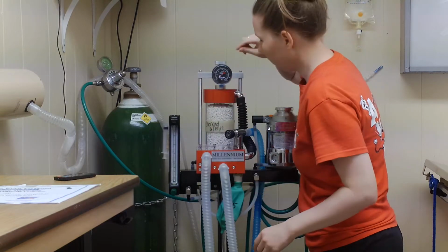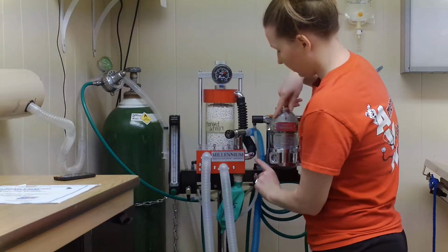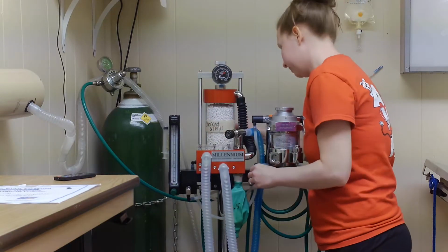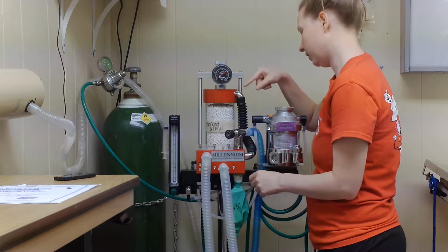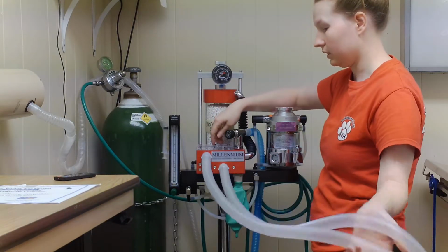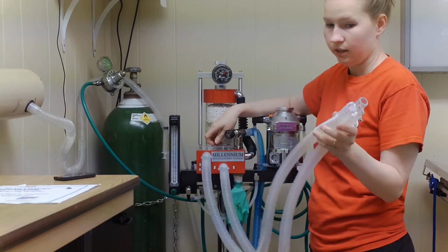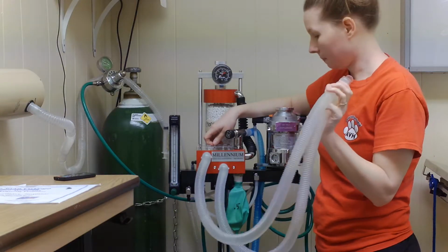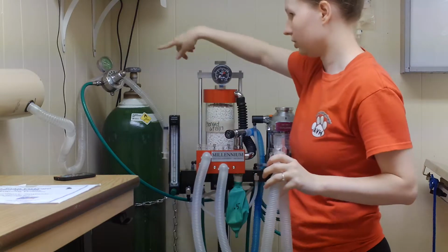But you see that again, the gas will come through this hose through our soda, and this little hose right here will come down, and these two hoses are our inhale, exhale, which will be going straight to the patient. So the oxygen is already on.